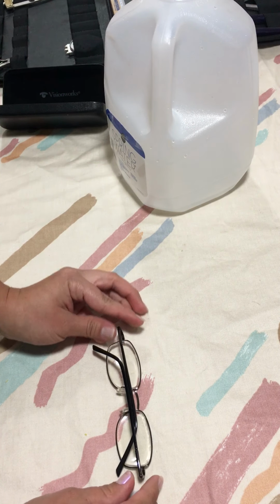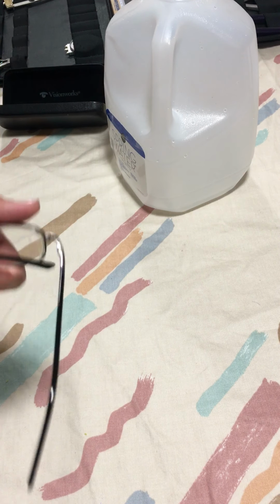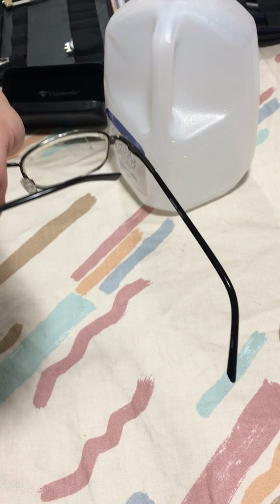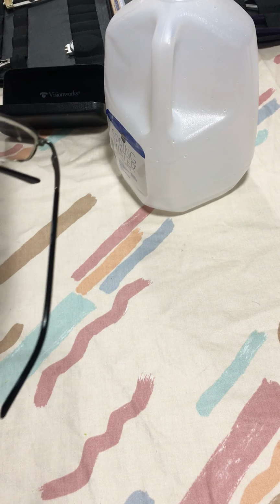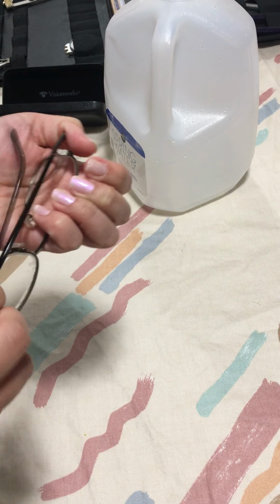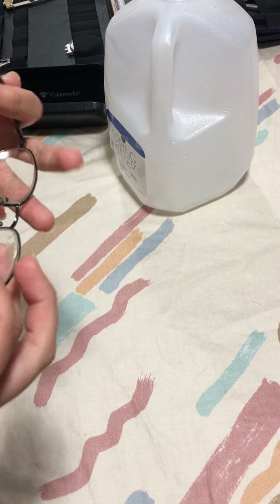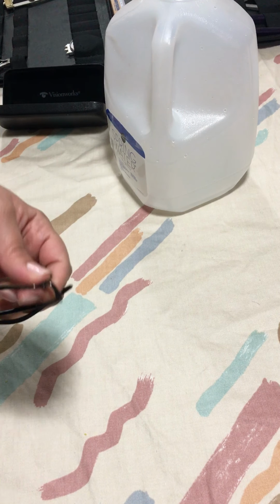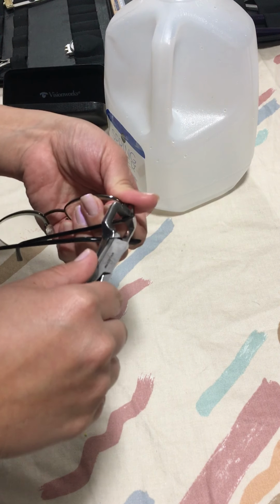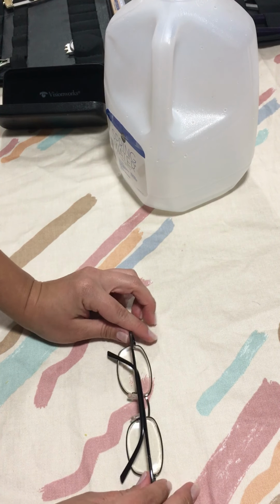I will check the temple bend. I am going to fix the left side just a little bit, but just a little bit. The temple that I'm working on should always be closed, never open. So I will push down the wide angling plier just a little bit, just so it's more leveled. Okay, let's see. Okay, now the other side. See? Okay, now that's a lot better again.